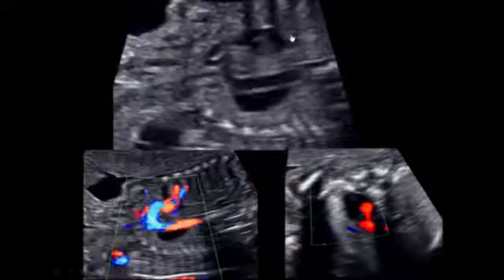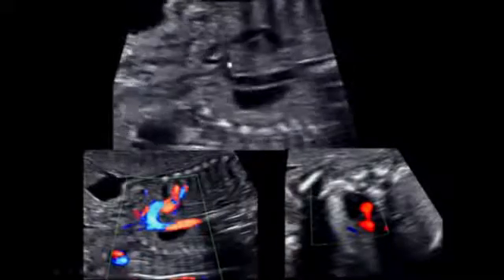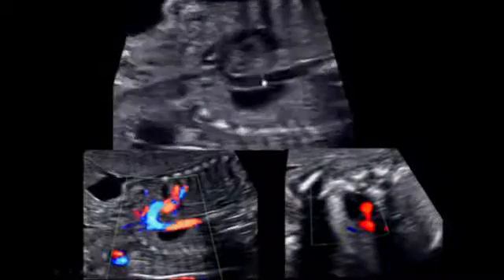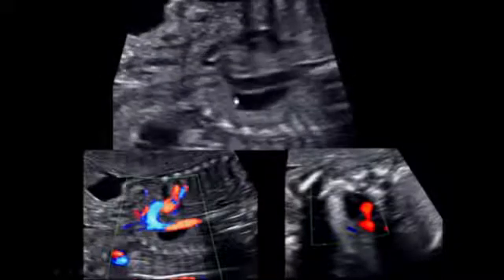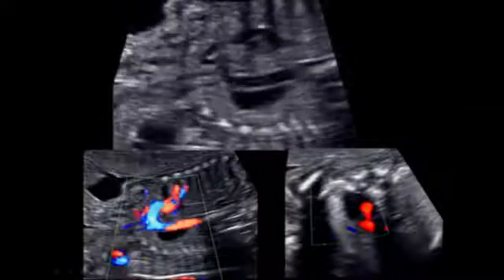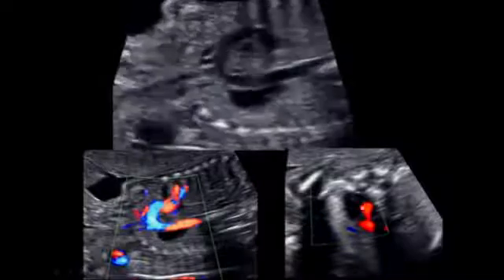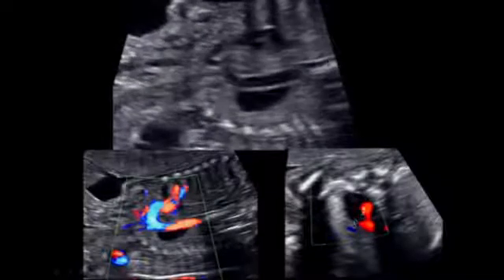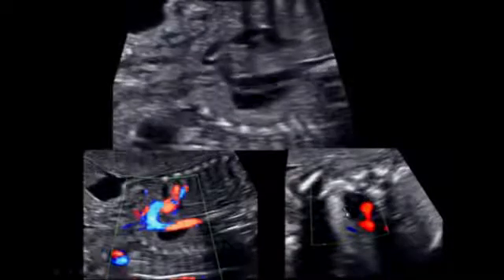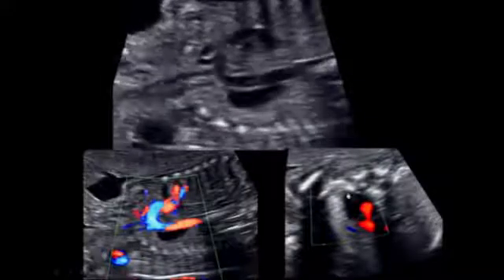Here's another magnified view of something you won't see very often, a magnified view of the ascending aorta, and we know it's the aorta. You can see the branches going off up into the head, and it turns the corner and descends here, and there's a fluid collection posterior to the descending aorta in the upper chest. When we put color on, we can fill the aorta and see that this is not a vascular structure. Here it is transversely, so it's a cystic structure in the posterior mediastinum, almost certainly either a duplication cyst, a bronchial duplication cyst, or a lymphatic malformation.